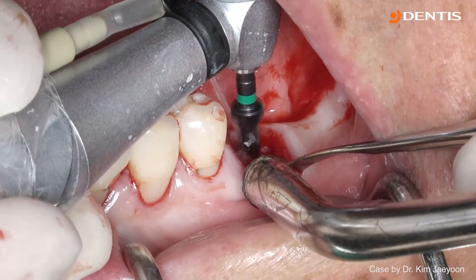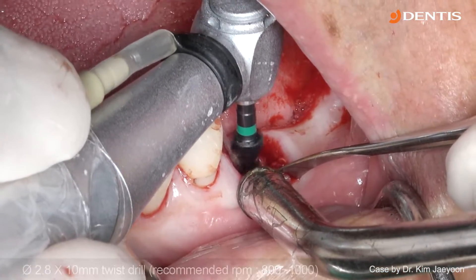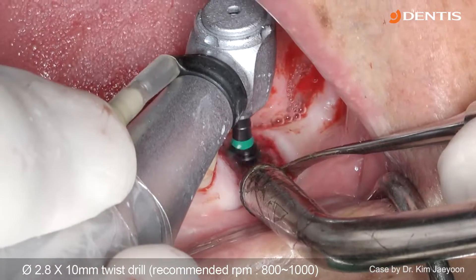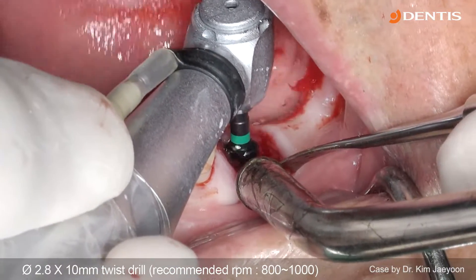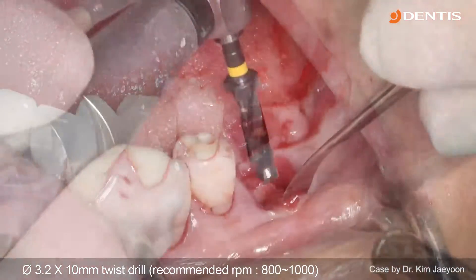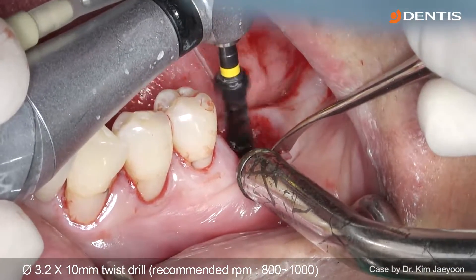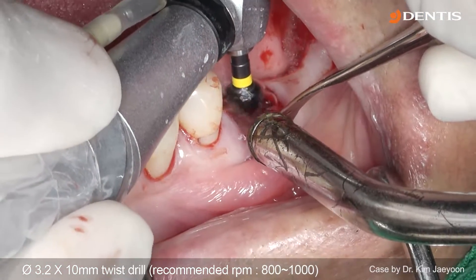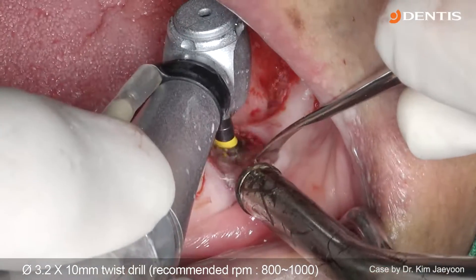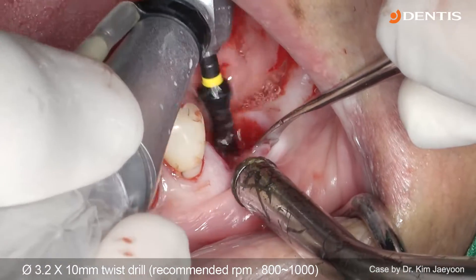Then I continue drilling sequentially. The most important point of immediate implant placement is to keep drilling on the same site with the same path throughout the drilling sequence.